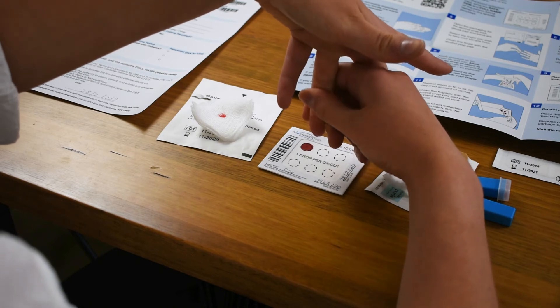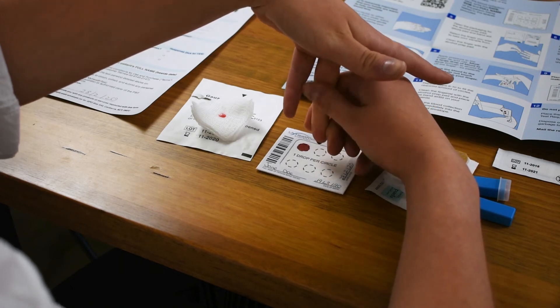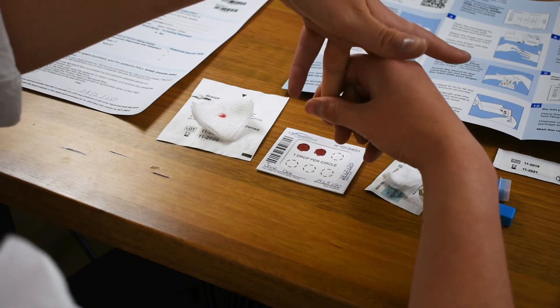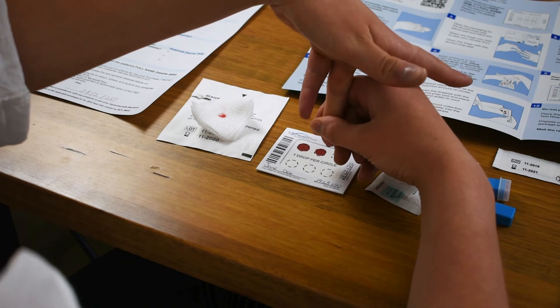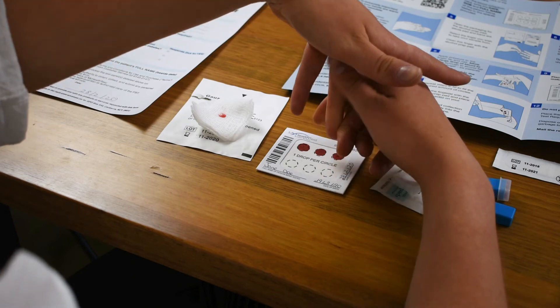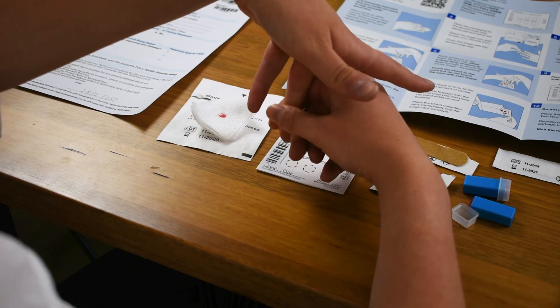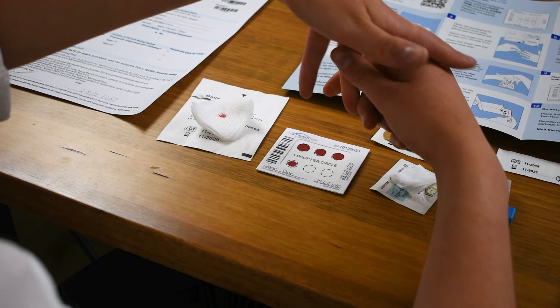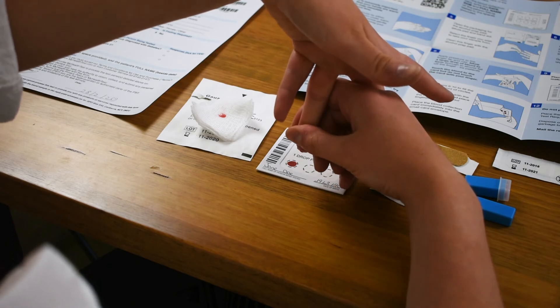Repeat this, continually massaging, until you've filled the required number of circles. Don't worry if your blood drop goes outside of the circle — these are just a guide for the size we're looking for. If you're having trouble filling an entire circle, try again on a new circle. If your blood spot looks slightly smaller, try again on a new circle. Keep massaging down the finger and be patient.